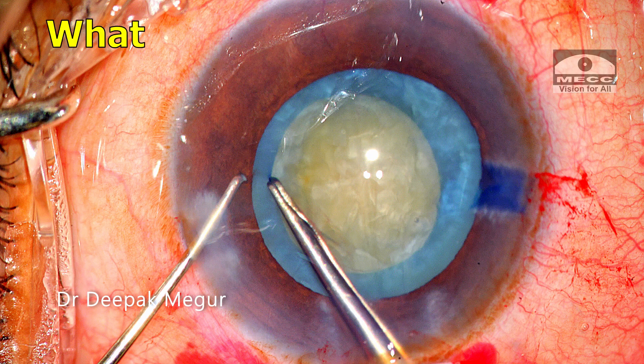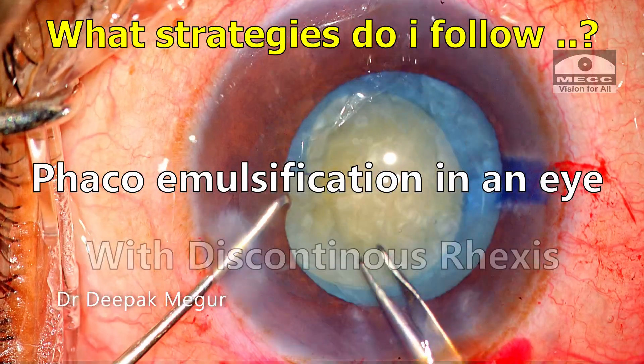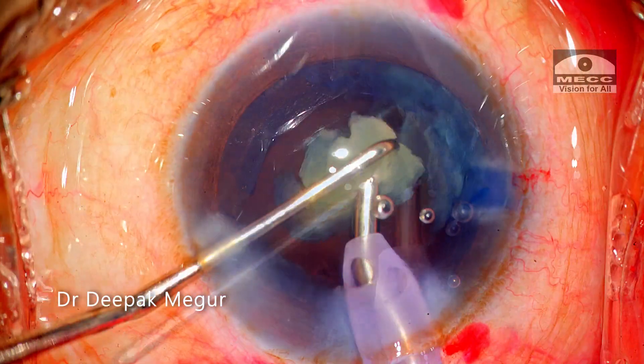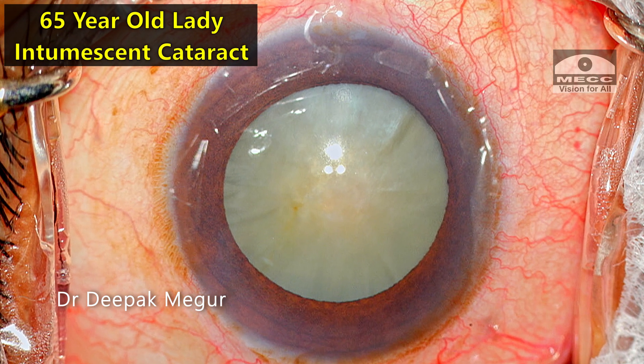Hello friends. What strategies do I follow when I perform phaco emulsification in an eye with a discontinuous rhexis? Let me demonstrate them through this case. This is a 65-year-old lady with an immature cataract.